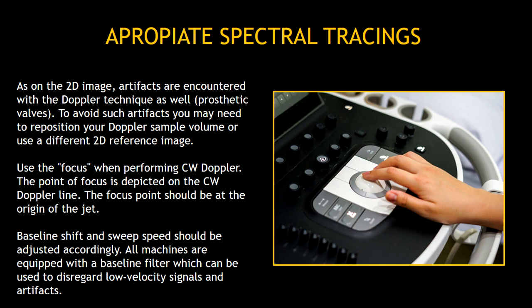Use the focus when performing continuous wave Doppler. Baseline shift and sweep speed should be adjusted accordingly. All machines are equipped with a baseline filter which can be used to disregard low velocity signals and artifacts.